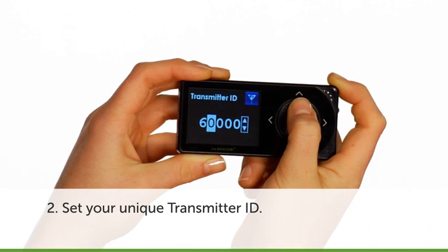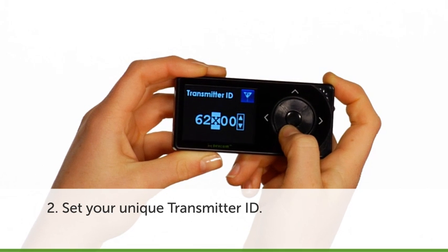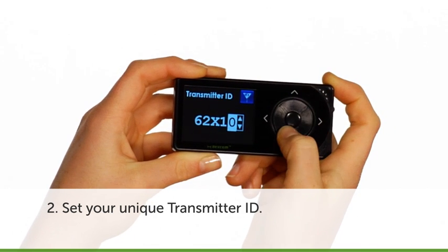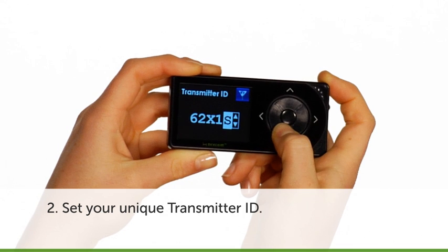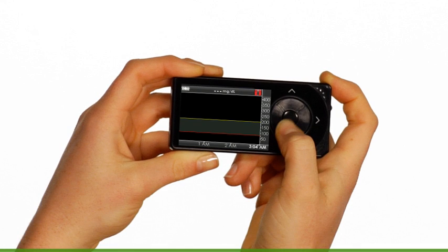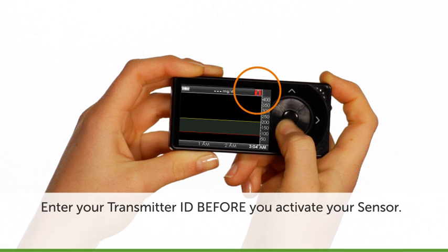Enter each transmitter ID letter or number into the receiver one at a time. Start with the first letter or number. Press the up or down buttons to adjust each value. Press the right or Select button to move to the next field. After entering the last value, press the Select button. Note, you can only enter your transmitter ID before you activate your sensor. During a sensor session, transmitter ID will not appear as an option on your device.